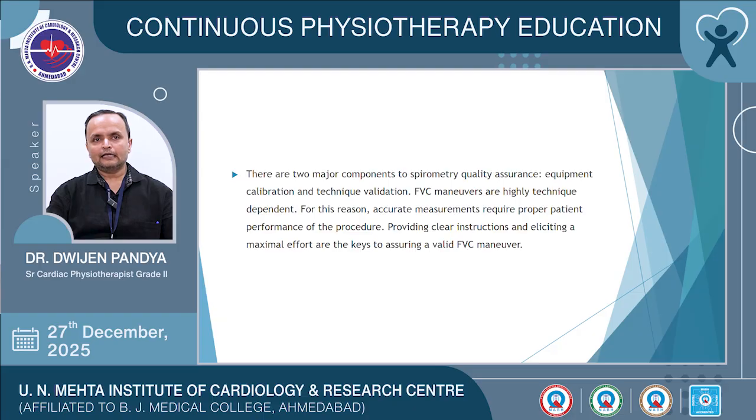FVC maneuvers are highly technique dependent. For this reason, accurate measurements require proper patient performance of the procedure. So, providing clear instructions and eliciting a maximal effort are the keys to assuring a valid FVC maneuver.